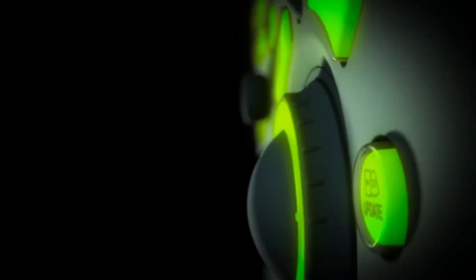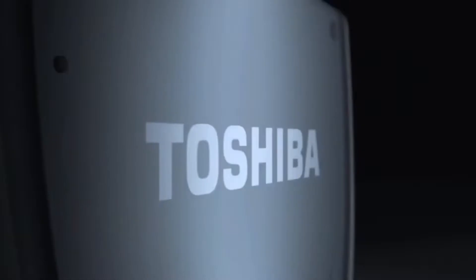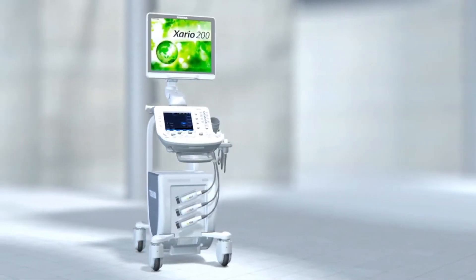Introducing the new Xario 200. This system takes the worry out of providing high-quality patient care with a smaller, compact ultrasound system, and is designed with outstanding versatility, flexible workflow, and high-quality imaging.